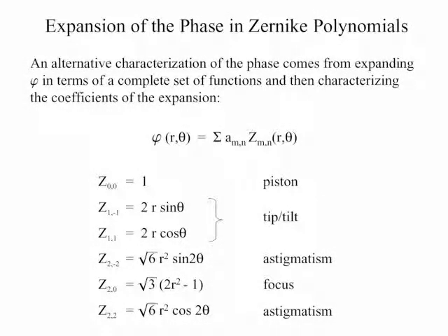So the idea of Zernike polynomials is this: the wavefront, this aberrated front coming out of the patient's eye, represents a sort of surface. And what we want to do is find a polynomial that will produce a surface that is the closest fit to the aberrated wavefront. The polynomials that we're going to be using are called Zernike polynomials.